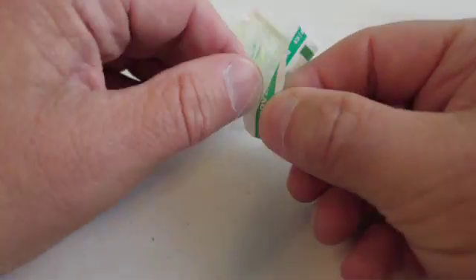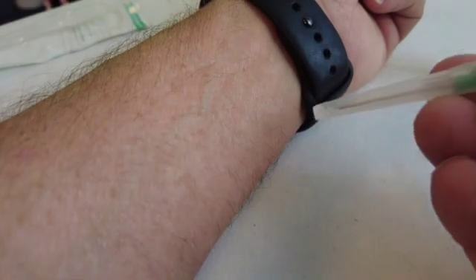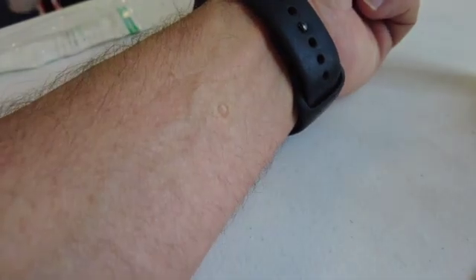The basic techniques for starting an IV in a moving ambulance are much the same as a stationary start. But there are a few ways to exaggerate normal IV start techniques that will help as you move down the road. Make sure to maximize vein visualization or location. If you've palpated a good vein and are afraid that you're going to lose your place, if you have to look away to grab some gear, mark that vein. I do it by taking the catheter and pressing the end of the cap into the skin above the vein. This leaves a nice little bullseye for your stick.